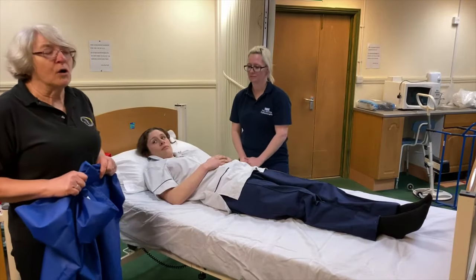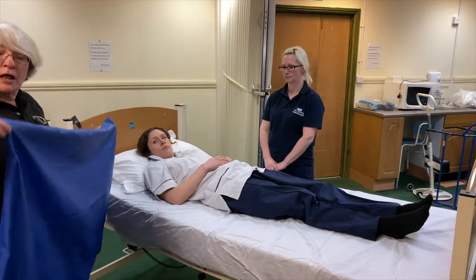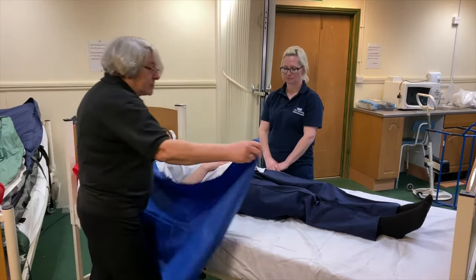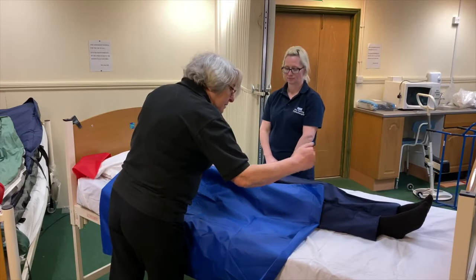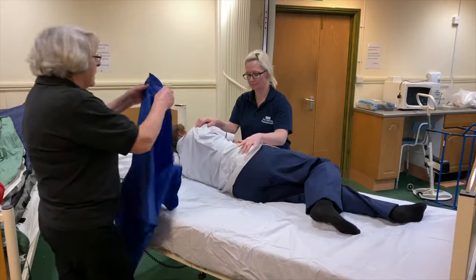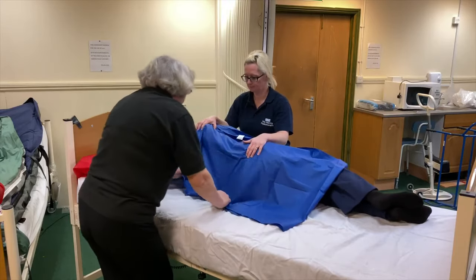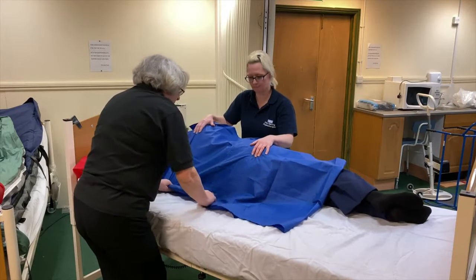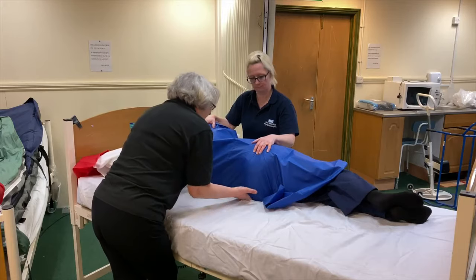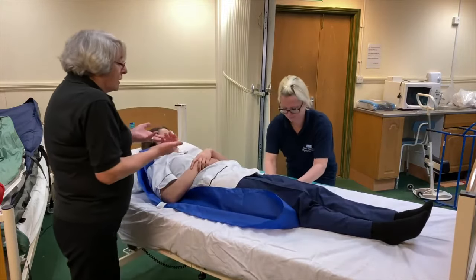Okay, so we showed the insertion of the long length slide sheet. In different hospitals there are different lengths, but in a lot of places we only have the 3/4 slide sheet. This means that if I put it up to Alice's neck, it's going to encompass most of the torso and the thighs, but it doesn't encompass the legs. So if we roll again, very good, look towards Lisa. Again, we're going to put this on the shoulder. I think I've been too generous, so I'm going to fold this up underneath her, flat of my hand under her body, and then roll her on her side, and Lisa can just peel that underneath.